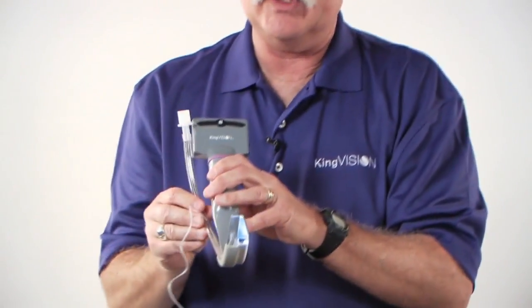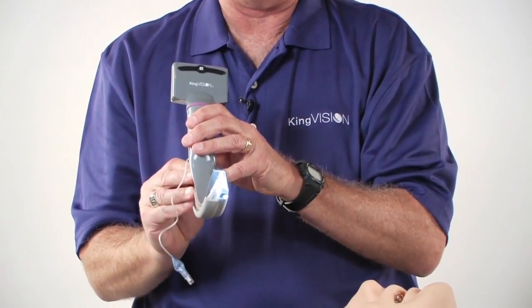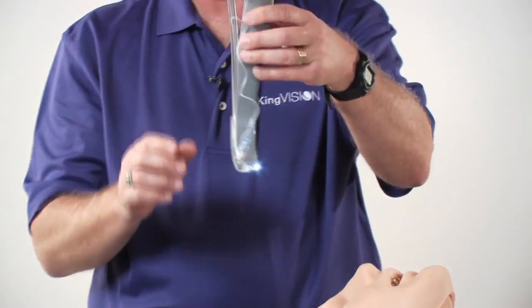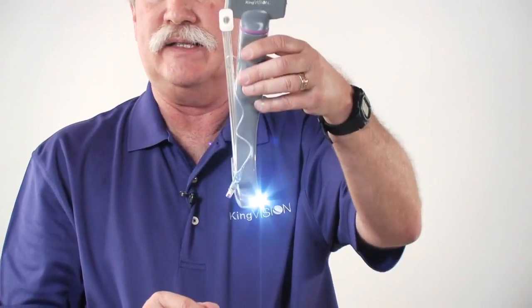It's also important to note that within the channel, you can twist the tube to gain a little bit of lateral control. And obviously, to get additional anterior control, you can actually lift with the blade itself.